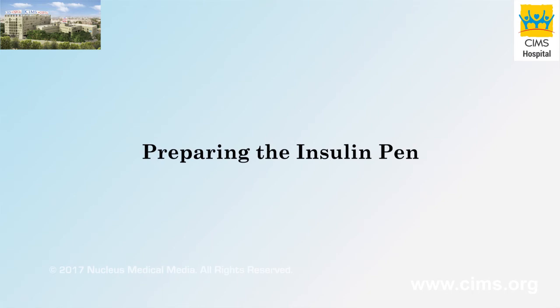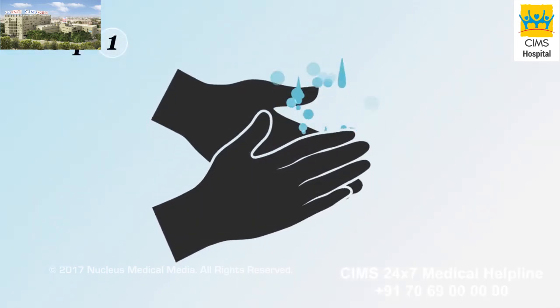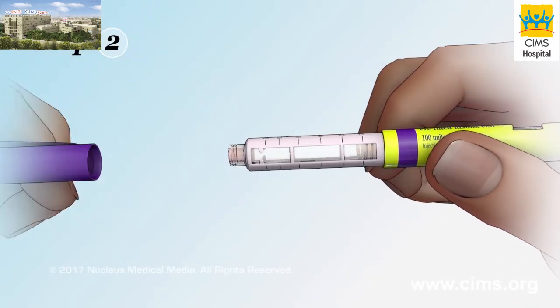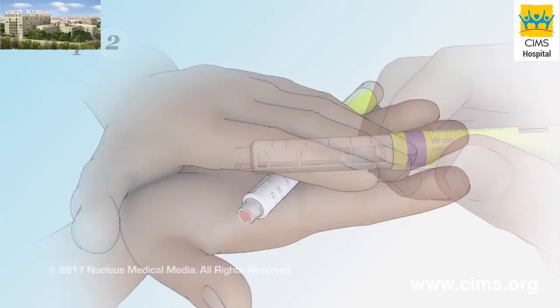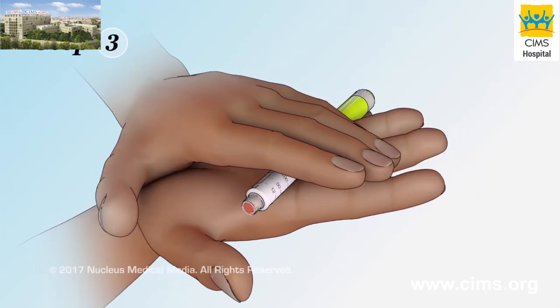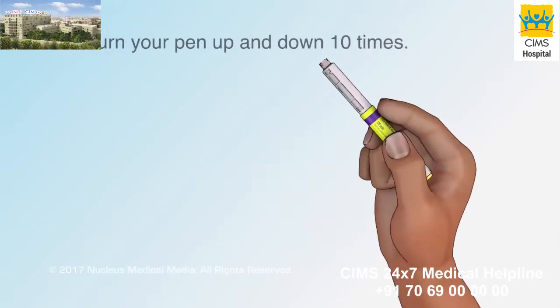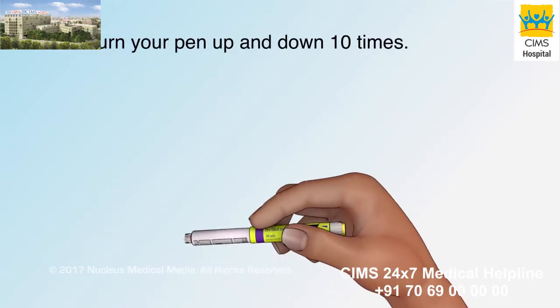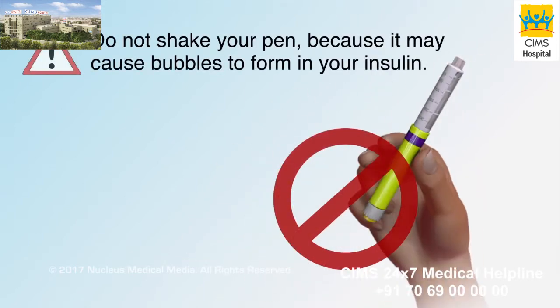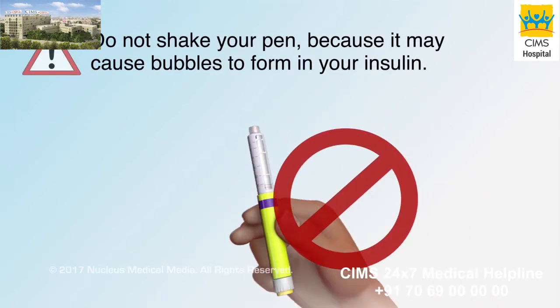Preparing the insulin pen. Step 1: Wash your hands with soap and water and then dry them. Step 2: Remove the cap from your insulin pen. Step 3: If your insulin needs to be mixed, gently roll the pen between your hands, then turn your pen up and down ten times. Do not shake your pen because it may cause bubbles to form in your insulin.